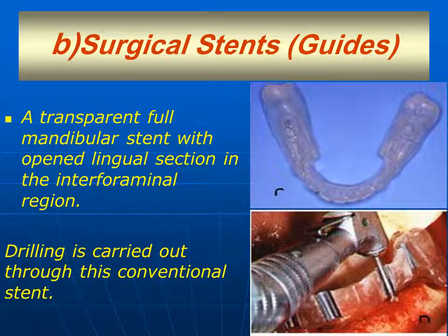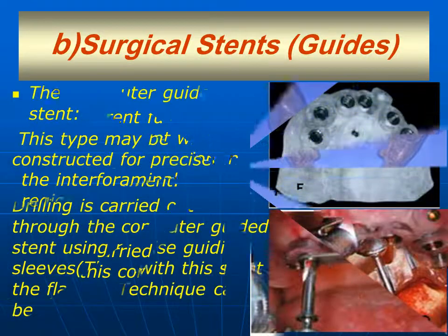Another type, we can use a transparent full mandibular stent, which covers the mandibular arch, and this stent contains an opening from the lingual side to expose the area in the interforaminal regions, and drilling is carried out through this conventional stent.